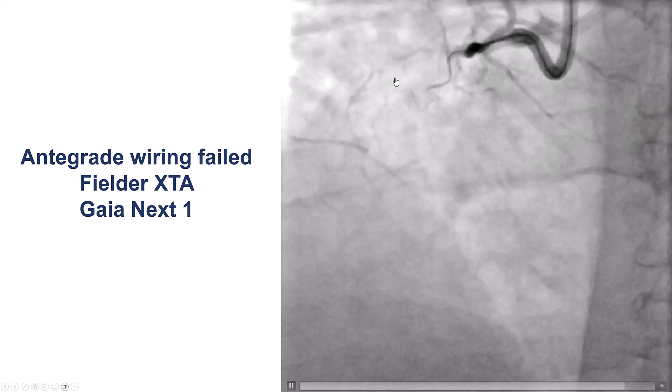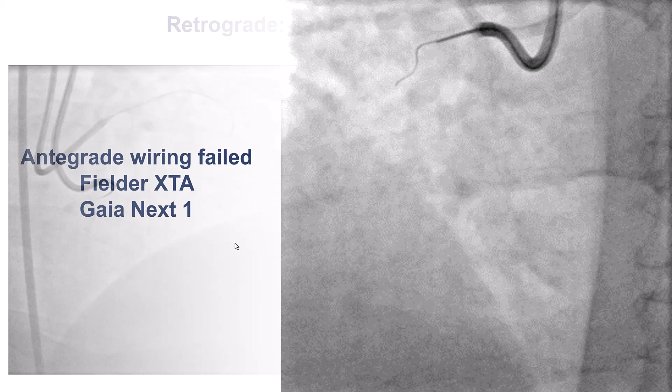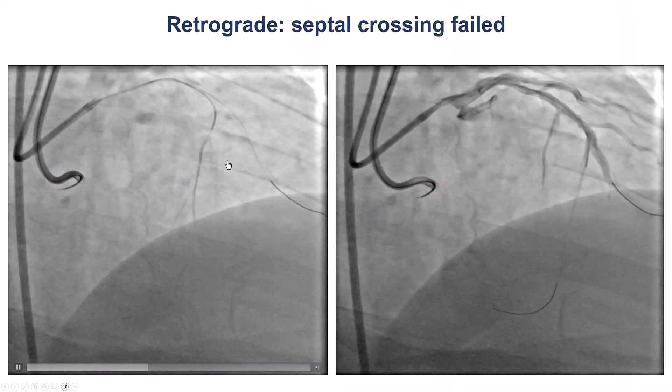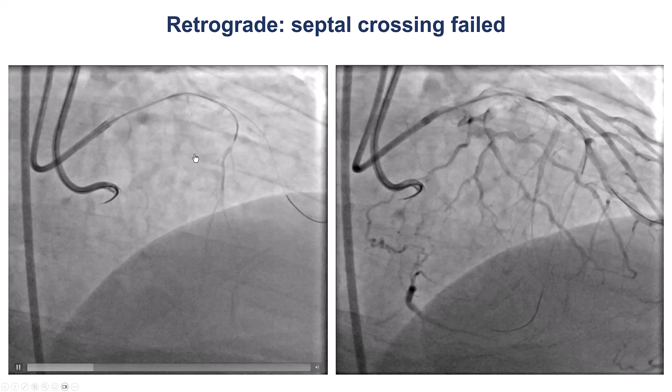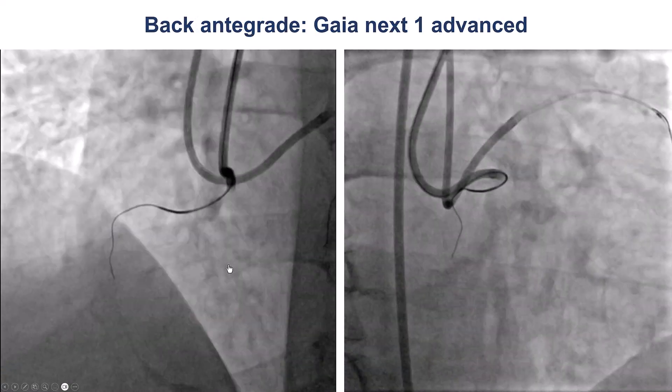We tried various guide wires in the antegrade direction — Fielder XTA, Gaia Next 1 — but we were unable to make much progress. We then switched to the retrograde approach, doing multiple attempts for crossing using both surfing as well as contrast injections, but we were unsuccessful.